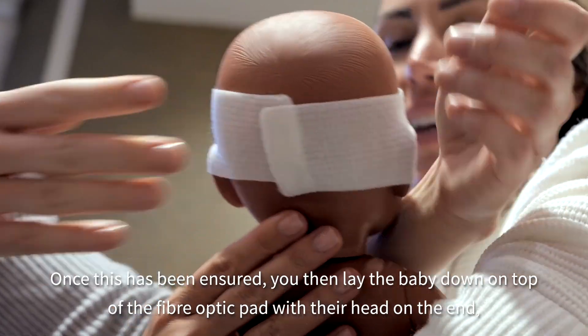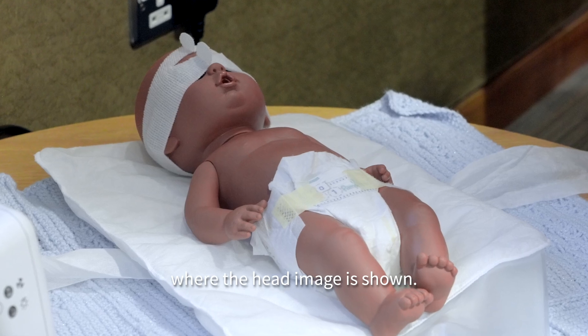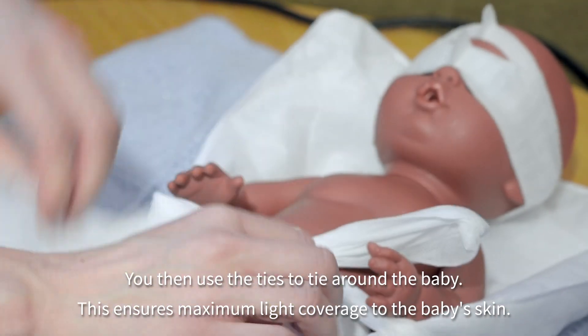Once this has been ensured, lay the baby down on top of the fibre optic pad with the head up on the end whereby the head image is shown. Then use the ties to tie around the baby. This ensures maximum light coverage to the baby's skin.